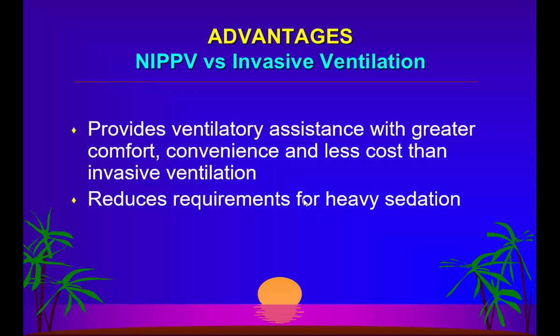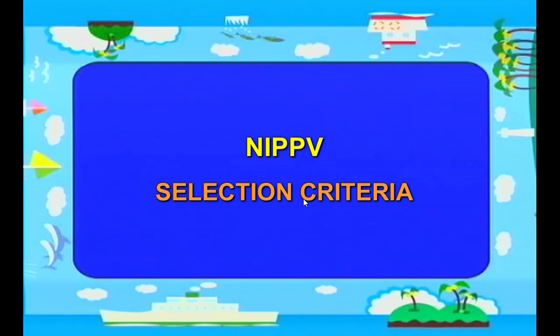You have to be on the edge. You have to be seeing this patient very regularly. You can't leave these patients at the mercy of the sister. Like if you intubate the patient, you're pretty well, right? The sister takes care of everything, but with non-invasive ventilation you have to be very, very careful. So as I said, invasive ventilation is sister-oriented, but non-invasive ventilation is doctor-oriented, with a lot of decisions you have to make which the sisters cannot make at the bedside.